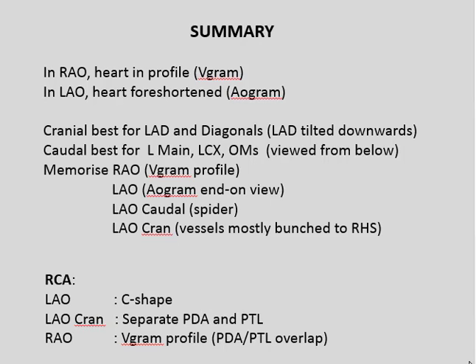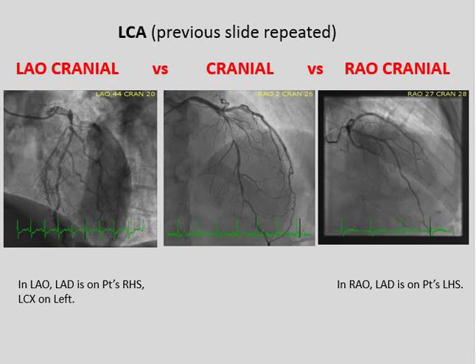I'm comfortable with what I've shown you and how I've explained it, although there is a lot. There is just so much. And this is the second last slide repeated to emphasize that LAO cranial movement versus that RAO cranial movement and how cranial angulations display the LAD prominently.